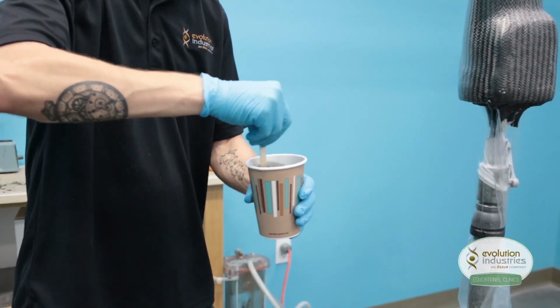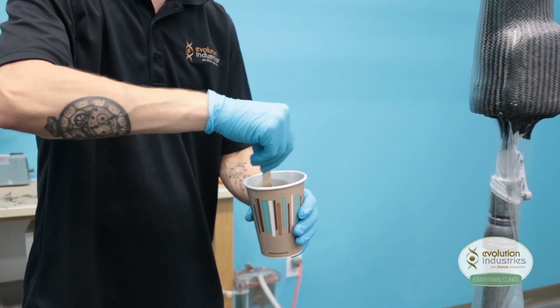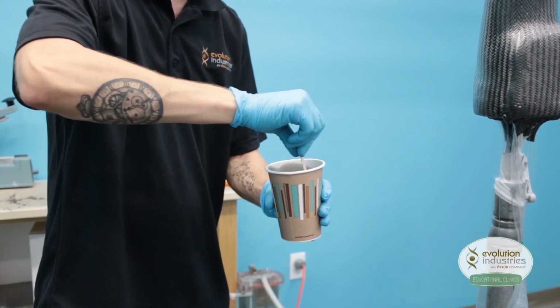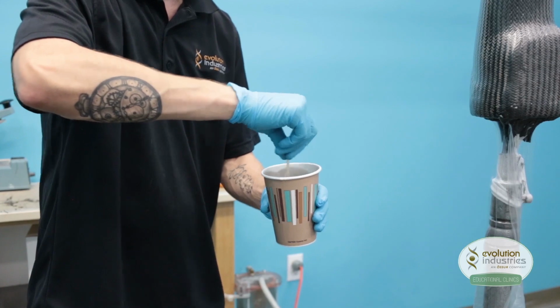You want to make sure you scrape the sides and the bottom, but be careful not to puncture through the bottom of the cup. And just make sure that cream hardener is well mixed into it.